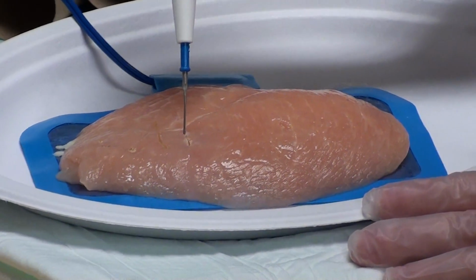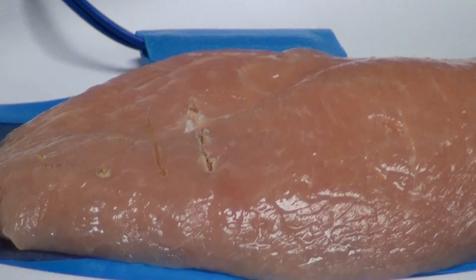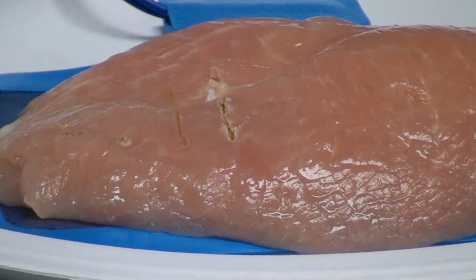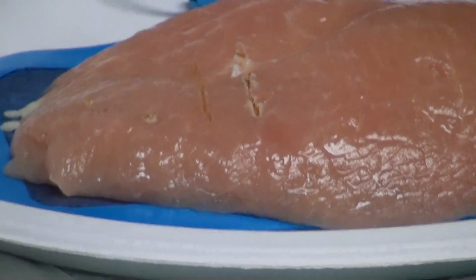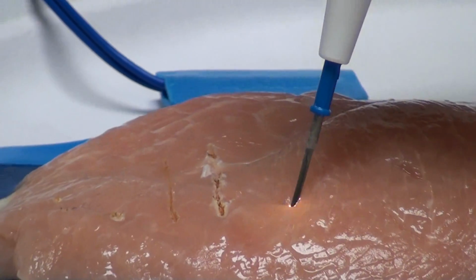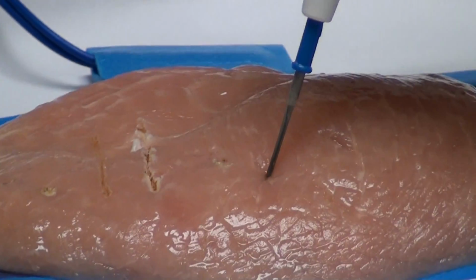You can see it travels much slower through the tissue. And then the last tissue effect that we can achieve using either the cut or the coag button is desiccation. However, this is performed using contact technique. So apply it to the tissue, press the button, desiccation, and then again with the coag button.